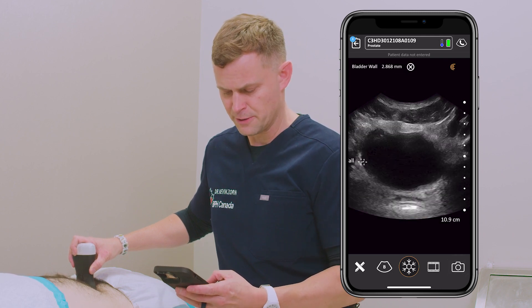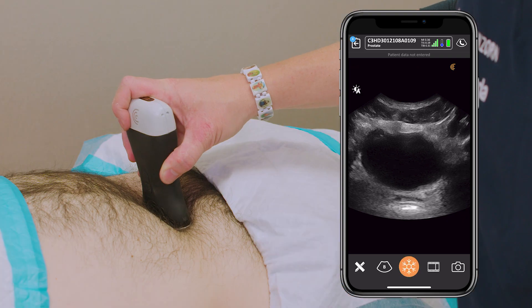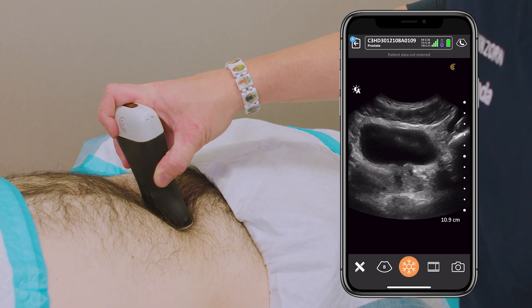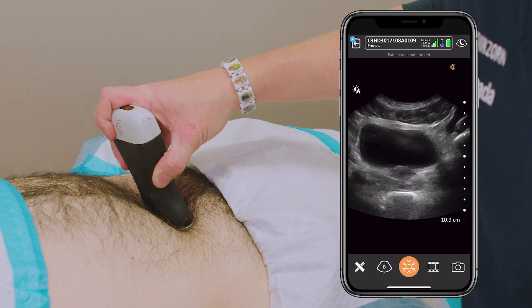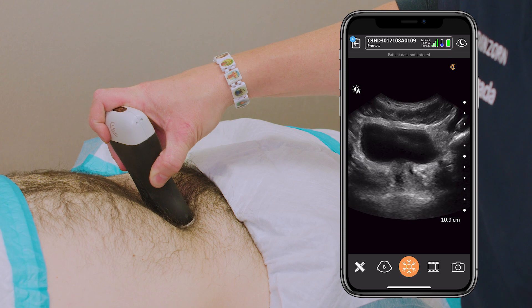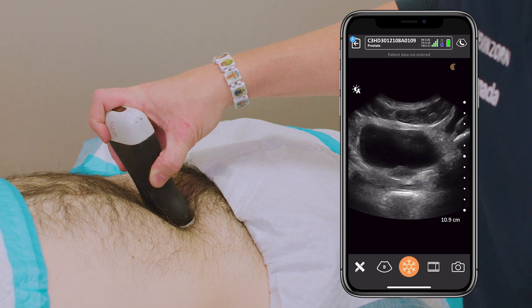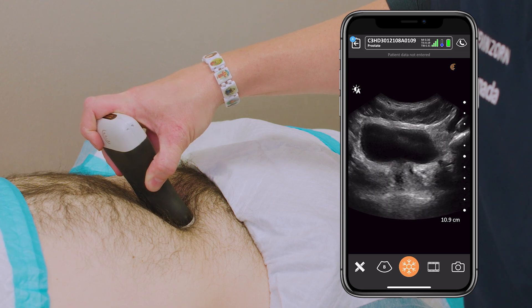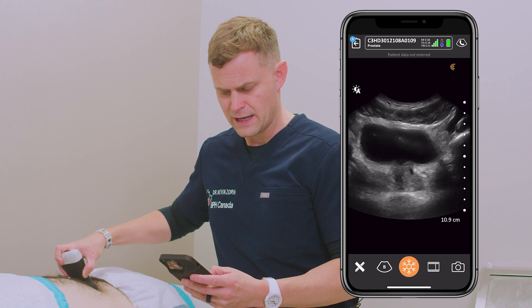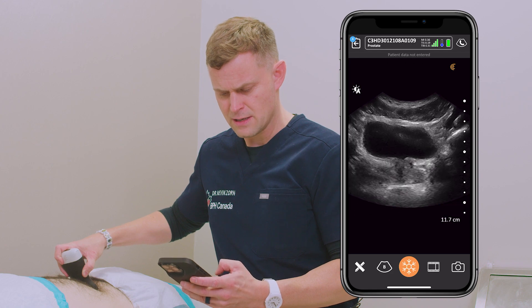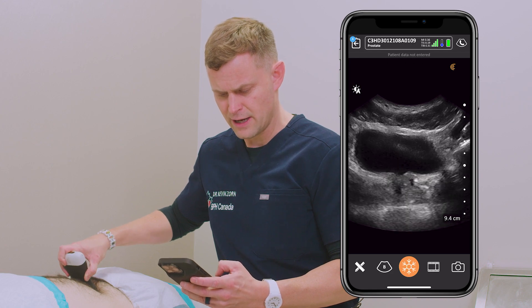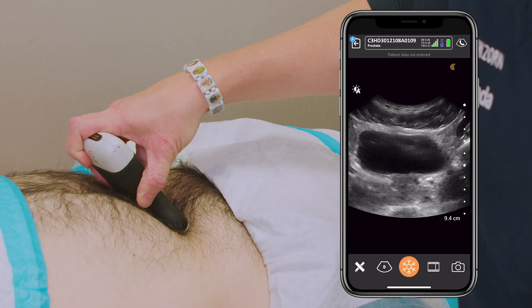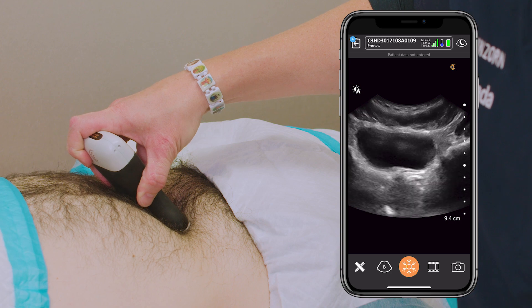Let's go ahead and save that image, moving my way down at the bladder neck to see if there's any median lobe — any protrusion centrally of the prostate into the bladder. Here we can see the prostate in view. I can zoom in, centralize the image, and there we go — I don't see any median lobe.